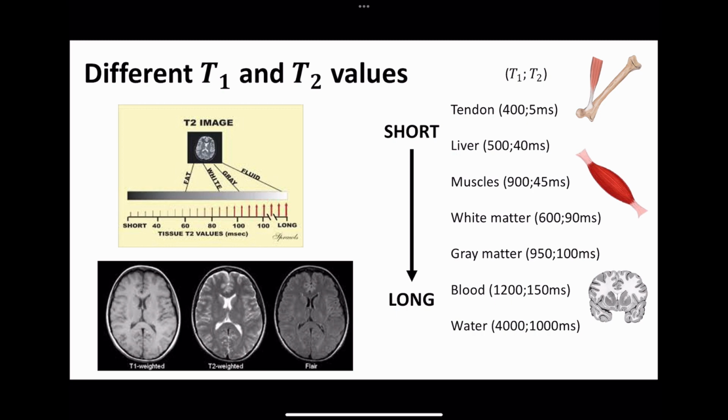In contrast, T2 weighted MRI images enhance the signal of water. T2 is ideal for visualizing inflammation, edema, and certain lesions, whereas T1 imaging provides more of a crisp image, highlighting the anatomy or the area being pictured. The specifics of the different appearances of sections is explained in the next example.